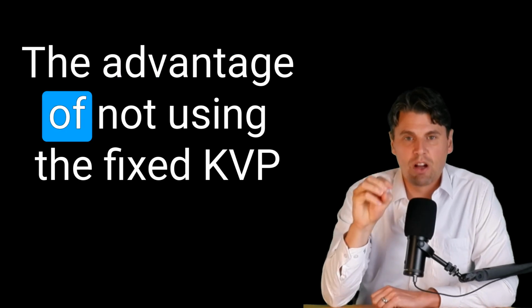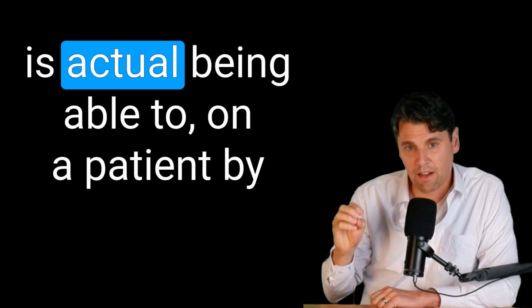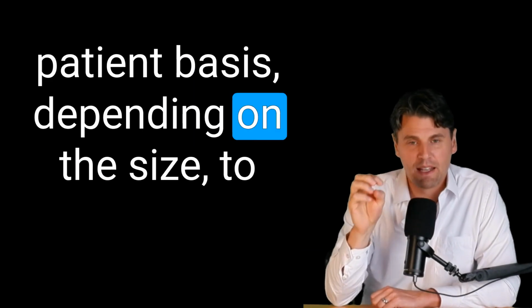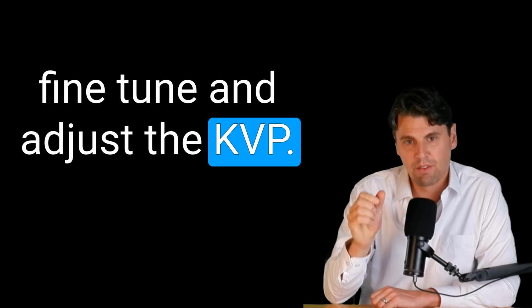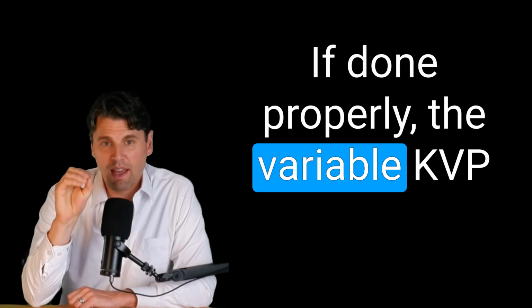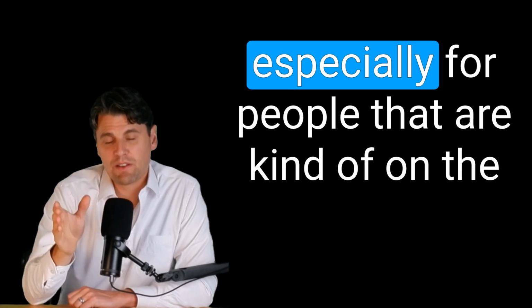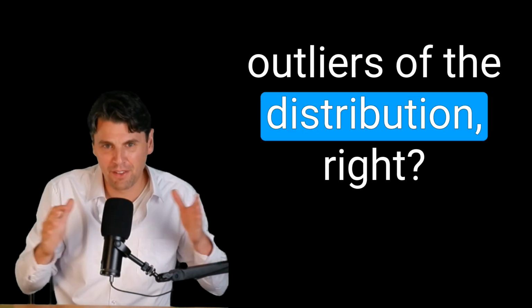The advantage of not using the fixed KVP is being able to, on a patient by patient basis, depending on the size, fine tune and adjust for a more optimal KVP for that type of acquisition. If done properly, the variable KVP can help to reduce the dose, especially for people that are kind of on the outliers of the distribution, right?